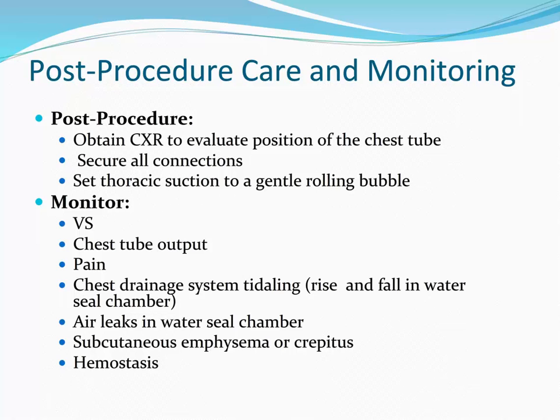sure that the patient is not having large volume losses, like over 100 cc's per hour, which is often associated with hemodynamic instability. In cases where there is a brisk output, 1-to-1 volume resuscitation may be ordered. So for every milliliter lost in the chest drainage, there is 1 mL in IV replacement. This is just a general rule for supportive care, not during a hypotensive crisis. Monitor pain. Chest tubes are painful, and patients should have pain-relieving medications ordered to support their comfort.